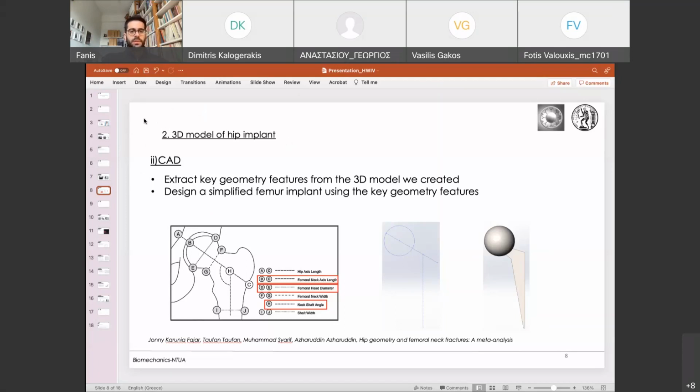As I said, we generated the 3D model in the previous step. And now, since we have it in an STL format, it's easy for us to measure some dimensions and see how it looks. So the first part is a general schematic representation of the femur bone. You might have the right or the left, it doesn't make any difference.